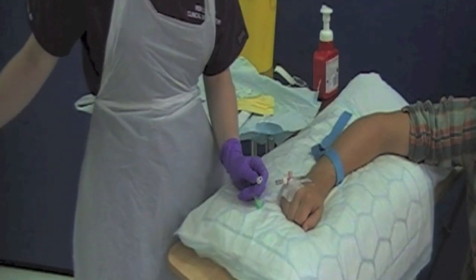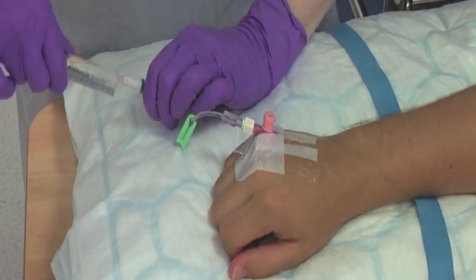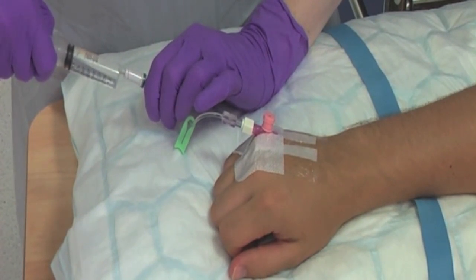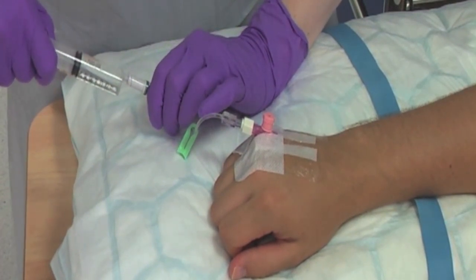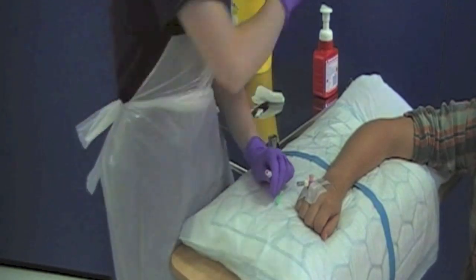Flush the cannula by securely holding the bionector away from its key part and connect the syringe prepared earlier. Flush with 5 ml of normal saline, watching for tissuing at the cannula site. If tissuing occurs, the cannula is not within the vein and you should restart the procedure. Remove the syringe and dispose into the sharps bin.